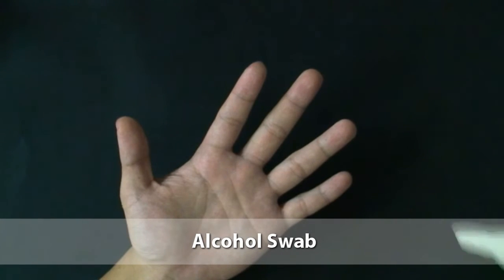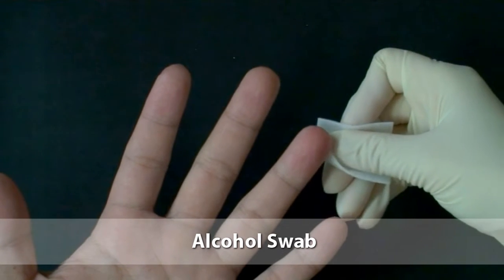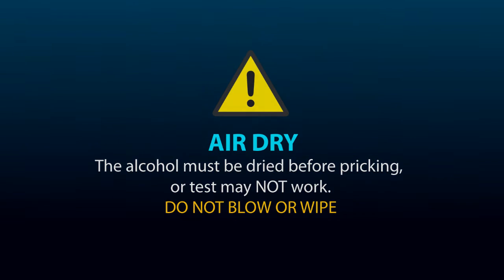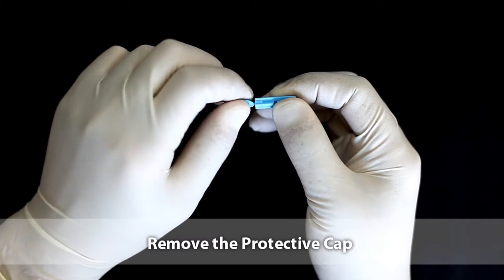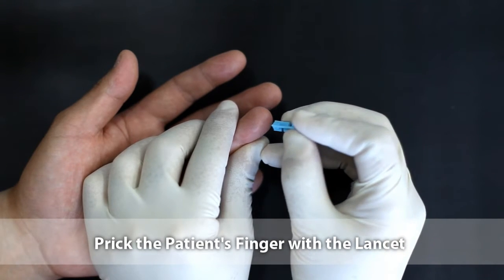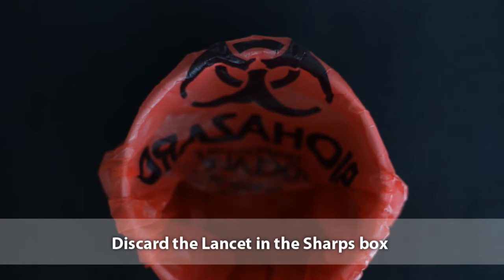Grasp the fourth finger of the patient's hand and clean the patient's finger with the alcohol swab thoroughly. After cleaning the finger, it must be allowed to air dry. Remember, the alcohol must be dried before pricking, or the test may not work. Do not blow or wipe the finger when you dry. Discard the lancet immediately after pricking the finger.